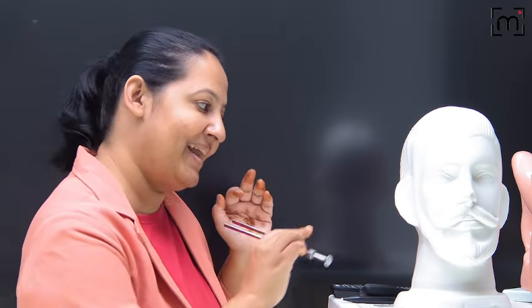Okay. But if the patient and I are hearing for the same duration, 10 seconds, 10 seconds, then either the patient is normal or the patient has conductive deafness. In conductive deafness also, the conductive pathway is bypassed. I am directly activating the mastoid. So the summary of the ABC: normally and in conductive deafness, it is the same, 10 seconds, 10 seconds. But in sensorineural deafness, the patient hears for a shorter duration and the examiner hears for a longer duration, 5 seconds, 10 seconds. This is the summary of ABC.